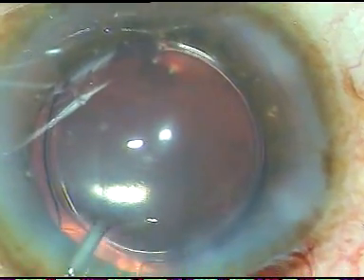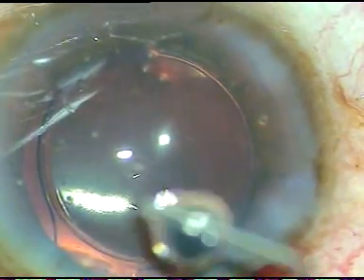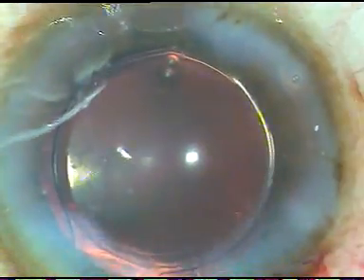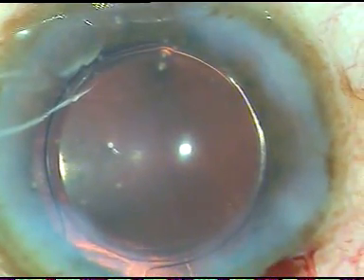This is moxifloxacin. I inject moxifloxacin, then I hydrate the side ports so that these side ports become waterproof wounds, and a final wash is given with balanced salt solution. The anterior chamber is formed then, and I conclude the case.